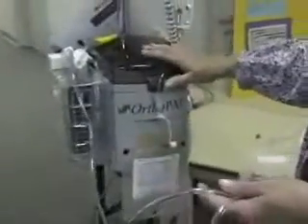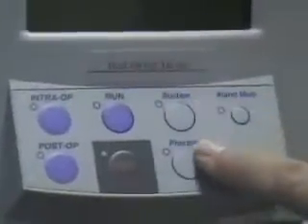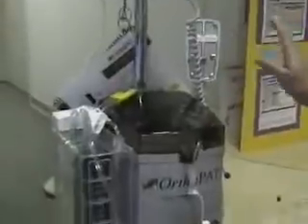So there are several things that we have to make sure of when we get the patient back, is that it's plugged in, that we have 4 lights showing. It's post-op, run, suction, and process. And that way the machine does its little processing and spinning. And when we go to reinfuse, we just press stop, and we change out the bag. We reinfuse the blood just like a unit of blood, with saline and blood tubing.